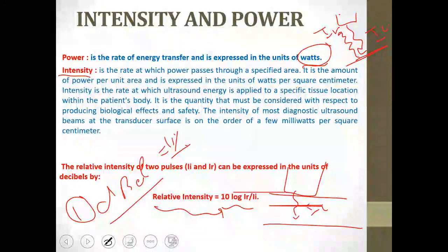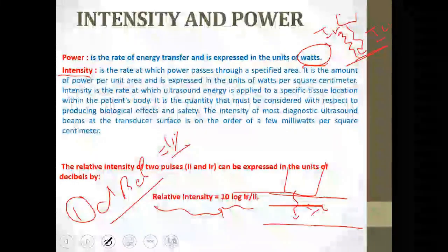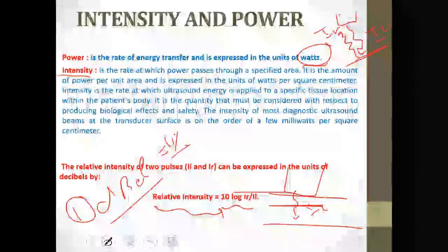Okay, now let us consider another question. In an ultrasound image, the image is usually bright from above, while the part below is dark. When I think about it, I say to myself, I'm sending a signal, and as it travels through the patient's body, it weakens. So the reflected intensity coming from a greater depth should be much weaker than that coming from the upper surface, right? The signal reflected to the transducer from the surface close to the transducer will be strong because the incident intensity was strong and hasn't experienced attenuation yet. The signal I'm receiving from greater depths has become weak.